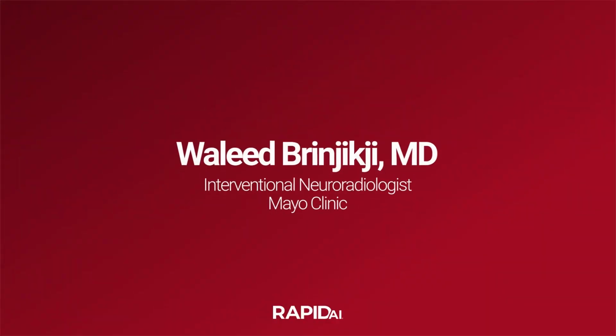I'm going to present a couple cases of patients who underwent serial aneurysm screening who had autosomal dominant polycystic kidney disease. And as you all know, this is a disease where there's a much higher frequency of cerebral aneurysms than there are in the general population. And patients do undergo regular screening. At least at Mayo, we do it at 1 to 2 year intervals, whether or not an aneurysm is found on the initial MRI, because they are known to have de novo aneurysms as well.